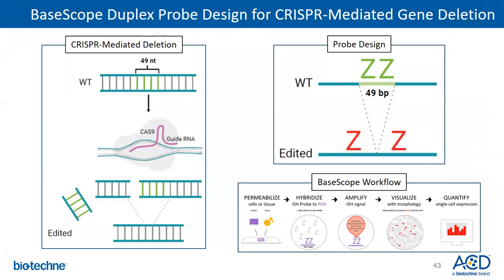dots. So if you are sectioning tissue, and you have thicker sections. For FFPE tissue, we recommend, I think, 5 to 7 micron sections. Fixed frozen, we recommend somewhere more in the order of 10 to 20 micron sections. The thicker section you have, the more dots you are going to see because you're capturing more of the cell and thus more transcript that's present there.